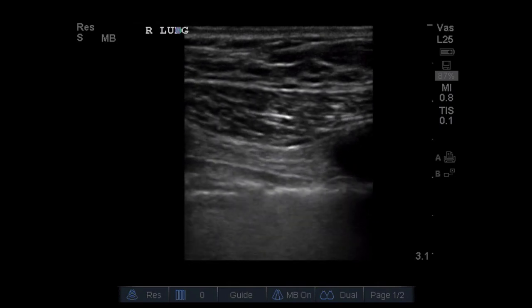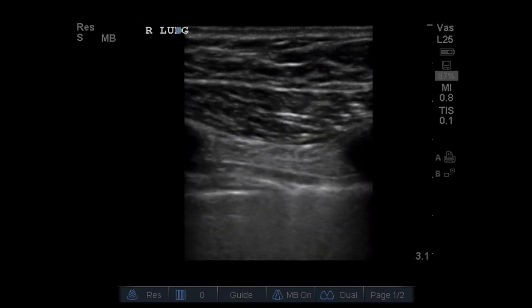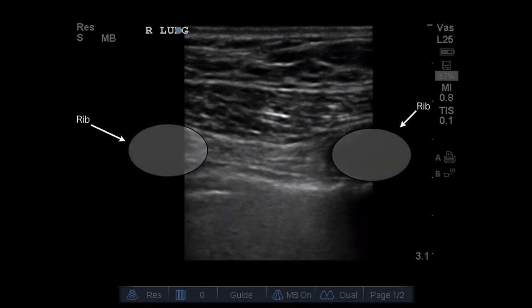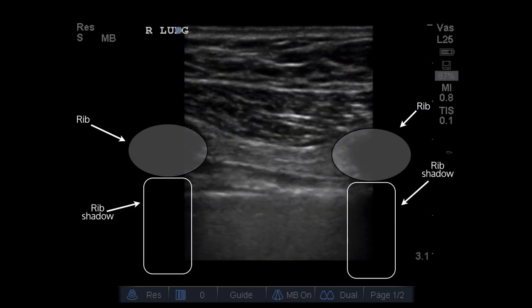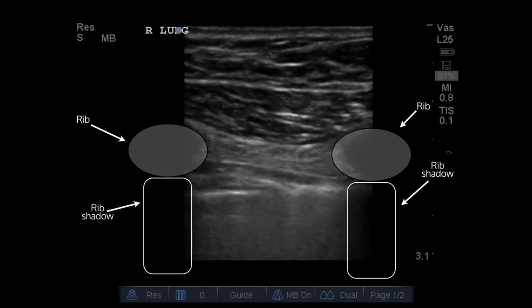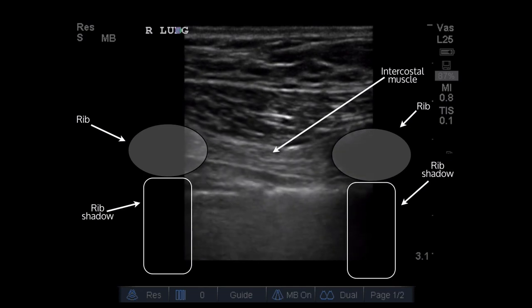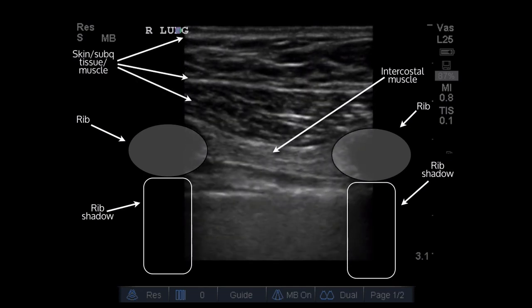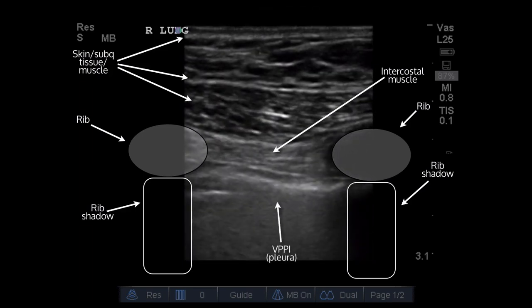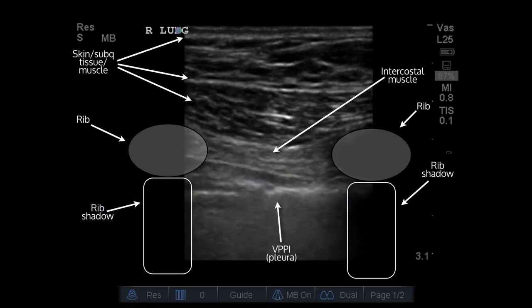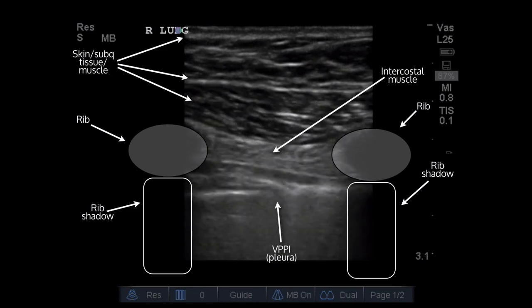This is what you're actually going to see when you're looking at the ultrasound image. You're going to see some cross-sectional cuts of the ribs. Underneath that, you're going to see a rib shadow — remember, sound doesn't penetrate bone very easily. Your intercostal muscle in between the ribs, skin, subcutaneous tissue, and muscle above that. Then underneath the ribs, you'll see the VPPI, which stands for visceral parietal pleural interface, or you can just call it the pleura.